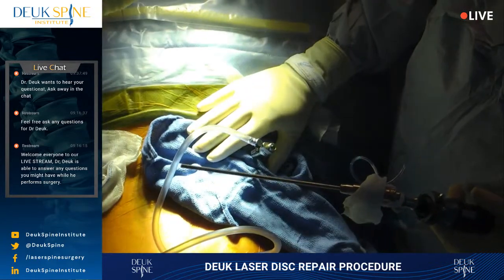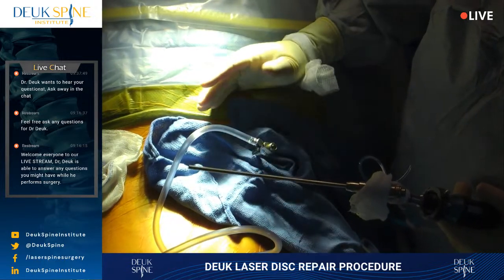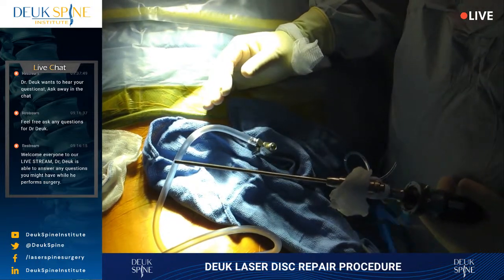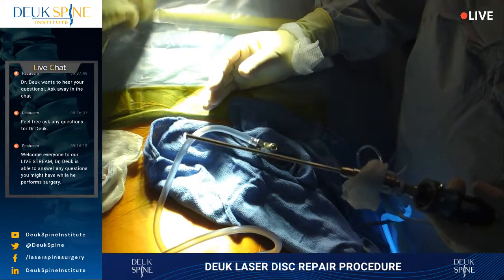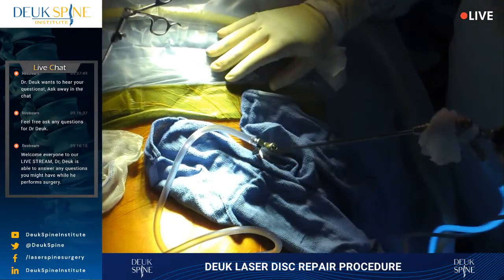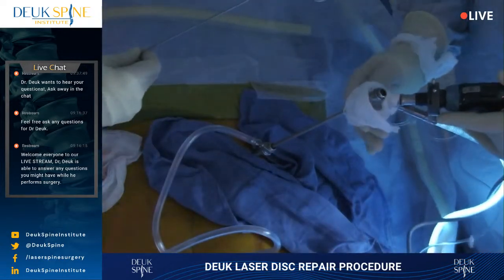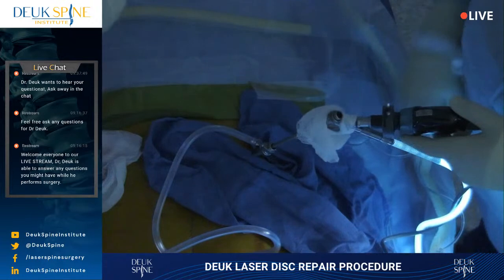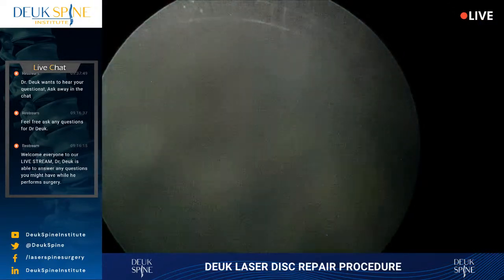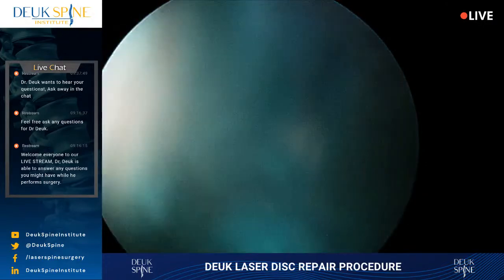Now, I didn't create endoscopic spine surgery, transforaminal surgery. There are other smarter, much smarter surgeons than me that figured it out. But I developed one thing, and that is the annular debridement. And that is the most important thing done in spine surgery today, because it eliminates pain. It eliminates back pain or neck pain or thoracic pain. And it eliminates leg and arm symptoms from inflammation. So until today, until now, the only thing done in the spine is decompression.